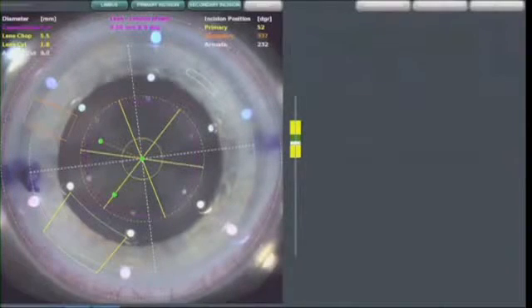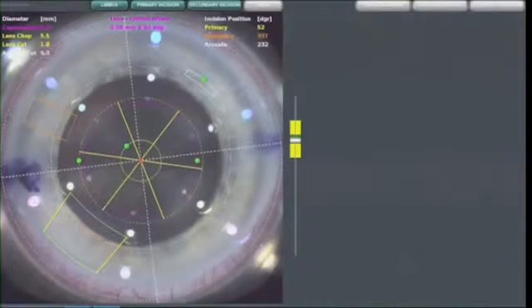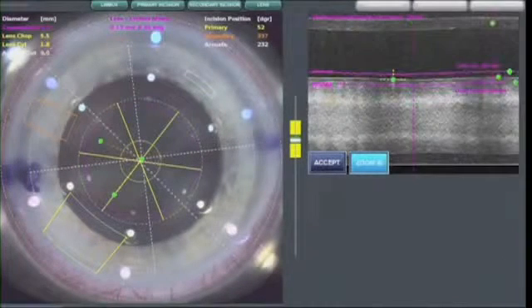Notice how we are positioning and centering the circle for the precise opening in the front of the cataract. This will help ensure the best possible lens implant position, which helps you to achieve your best possible vision.